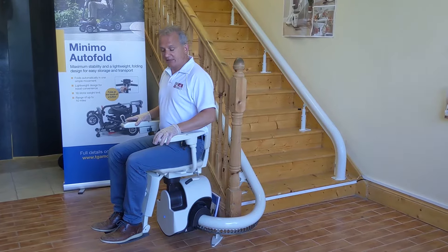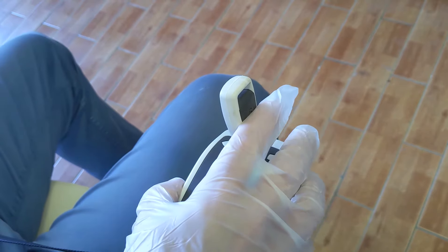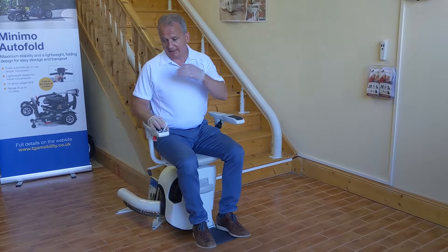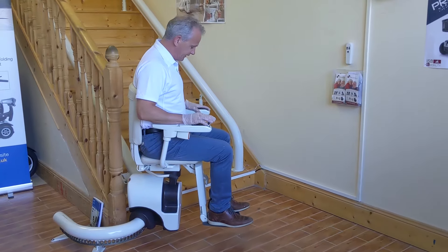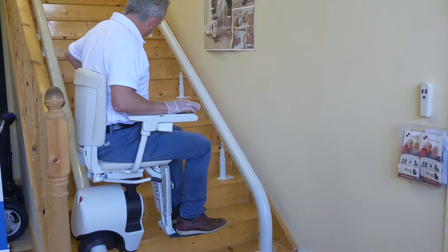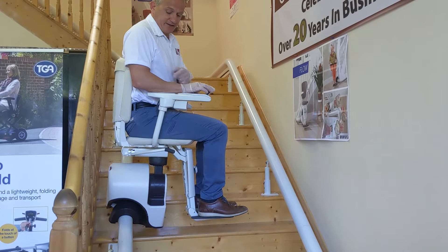All these lifts are now sensored, so if there are any blockages in the way it would cut out. We're going to press the stairlift to go up. It's negotiating a 180-degree parking bend — the Flow 2 can go external and internal; this particular model is going internal. It goes slower around the bend, then once it picks up the straight section of the track it goes a little bit quicker to get you upstairs as fast as possible. This one has a singular rail.